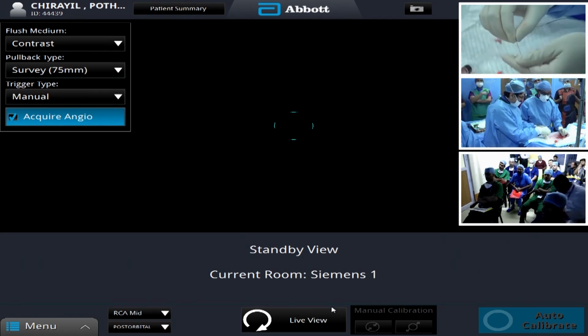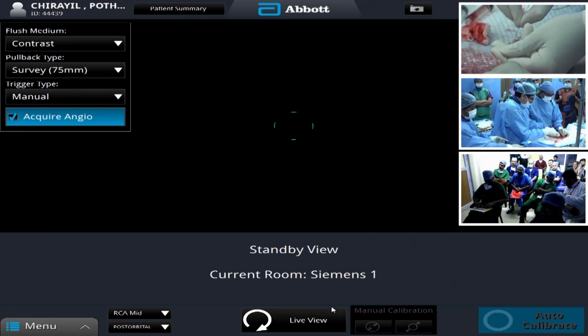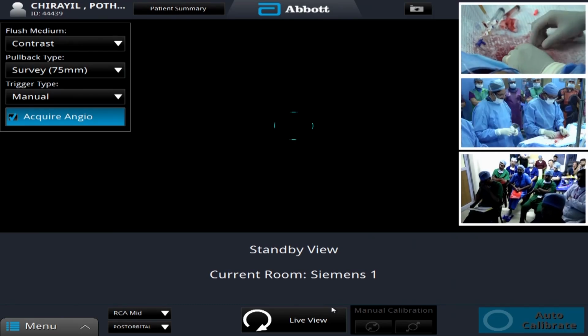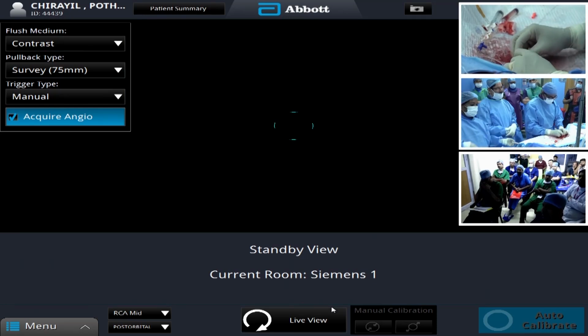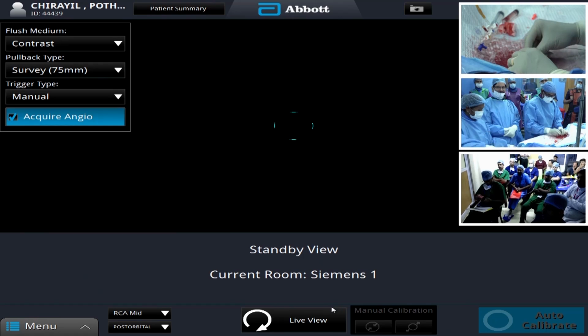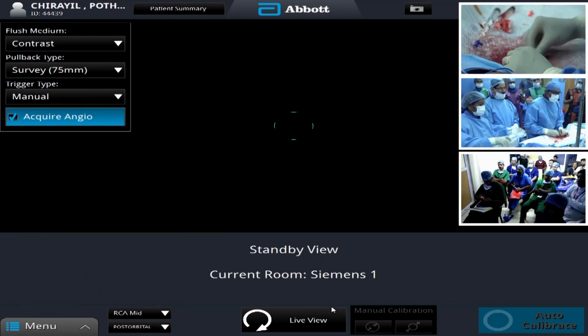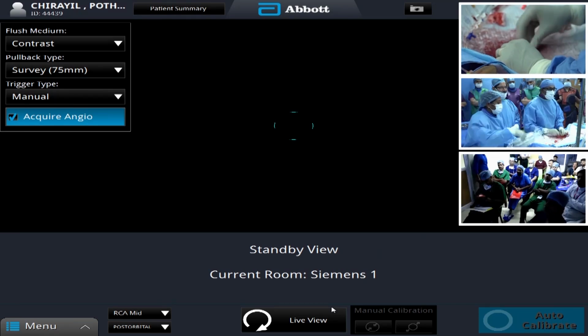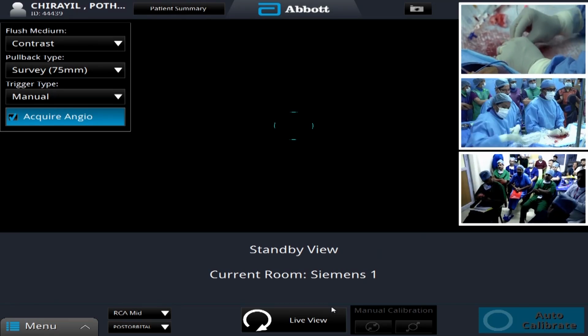But certainly we heard a pitch change. Probably the imaging should make us understand what exactly has happened. We can say definitely some plaque modification, some shallow gutters I'm expecting on the OCT at the tightest lesion site. Okay, we are in with the OCT catheter.